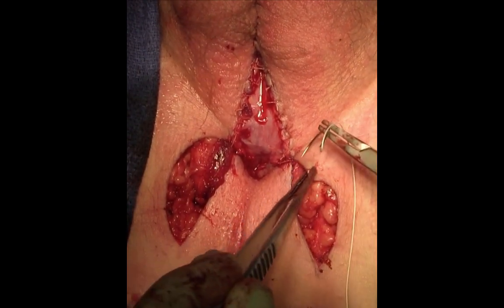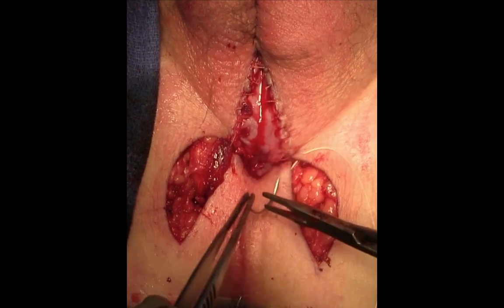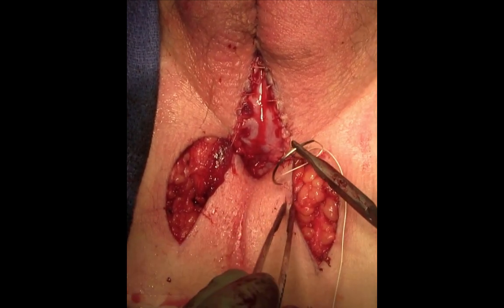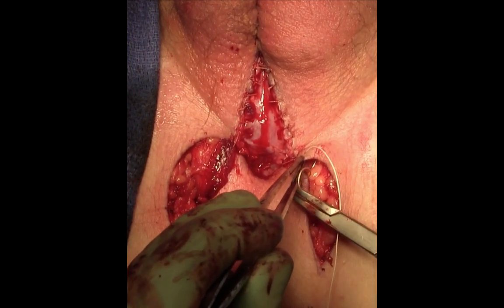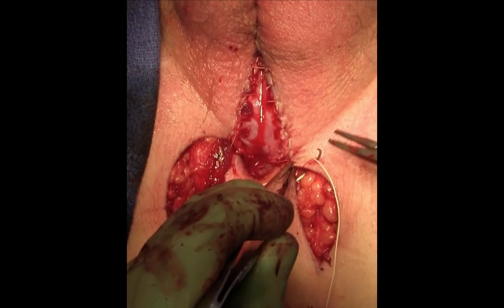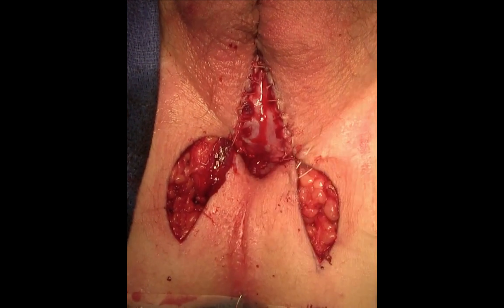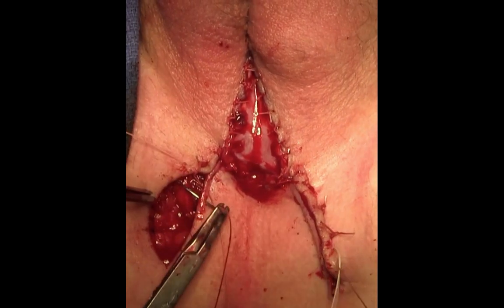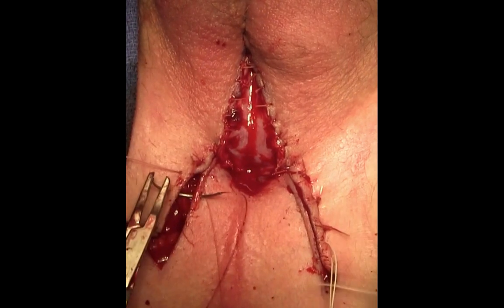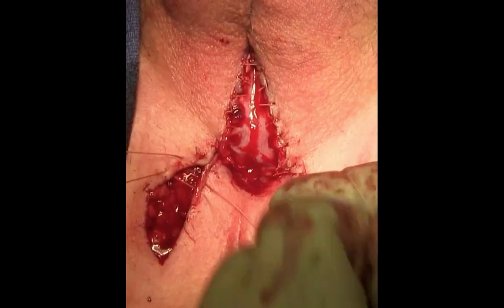The incision between the lateral aspect of the perineum and the advancement flap is the area that's in most jeopardy for skin breakdown. There's tension at this location, and often this wound can separate. If this occurs, then sitz baths and local care usually takes care of healing. The most secure closure that we've found is horizontal mattress sutures with 0 or 2-0 Vicryl along this area.